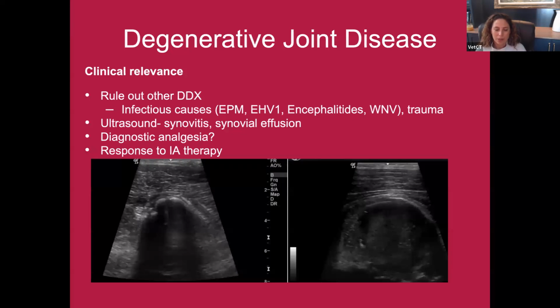We can use ultrasound. It's a really nice complementary modality for these. So we can look at the periarticular margins of the synovial facets. It always looks a little like a dolphin mouth coming out of the water to me, but there's one, there's the other. We can actually see the synovial membrane nicely. And we can use our ultrasound to look down into the joint and see any indication of synovial proliferation or debris. And so that may sort of add credence, if there's concurrent synovitis, to our finding that maybe, hey, the joint capsule is distended enough to be causing a problem, or this could be a source of pain.